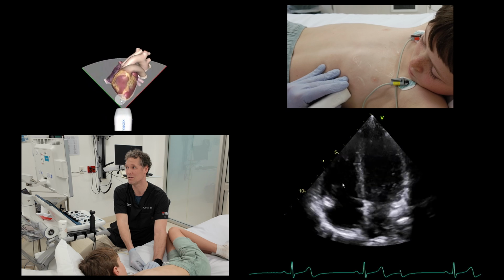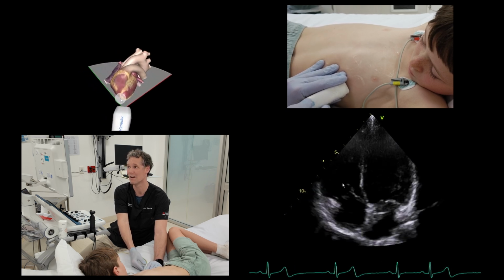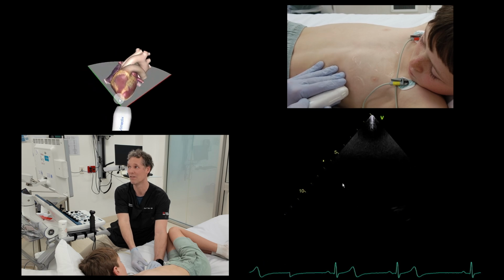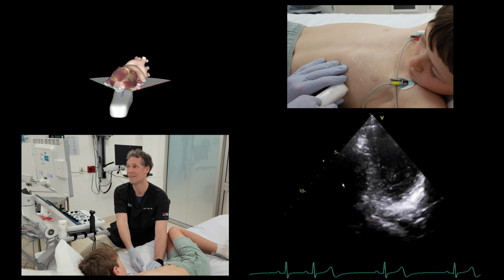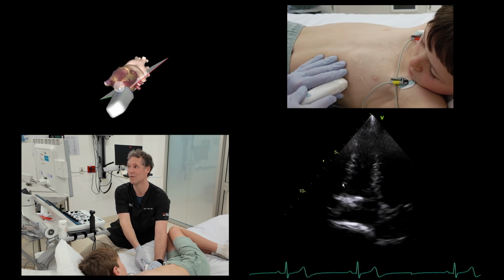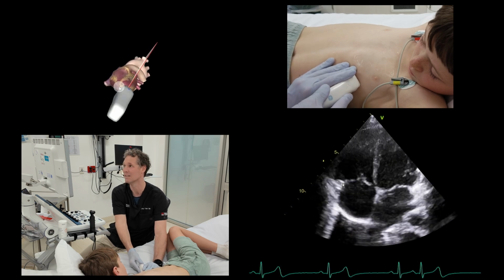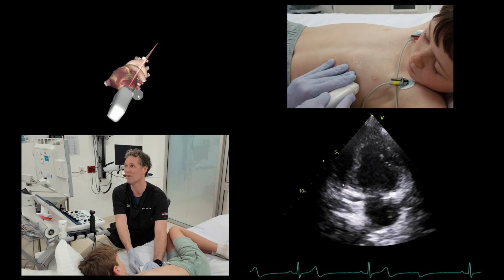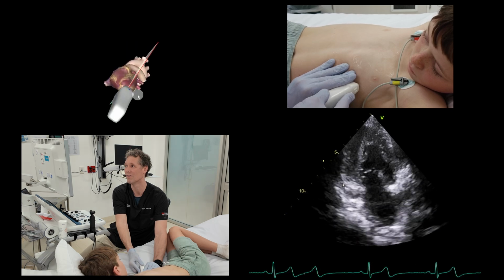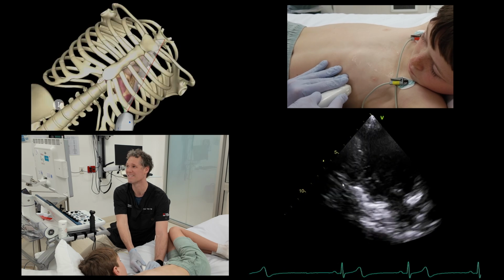To try and do the 2-chamber, I bring the left ventricle into the middle of the screen, and then I rotate round. Try and avoid the ribs. And this is the hardest view, particularly I think in kids it can be tricky. So I try and bring that left ventricle into the middle of the screen, rotate round. Try and do little bits of fanning, try and get from the true apex.